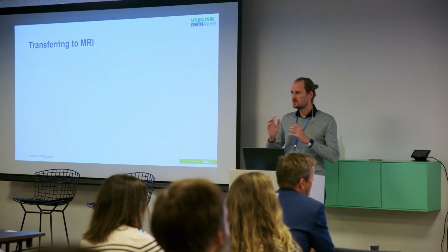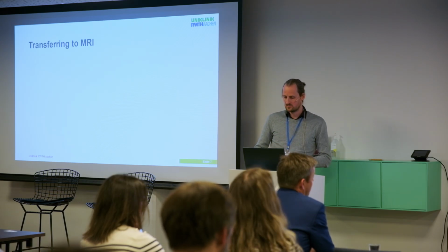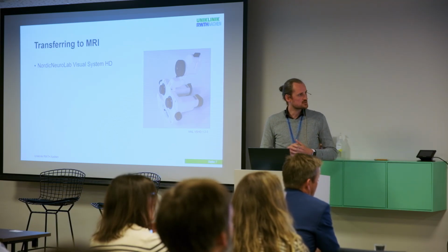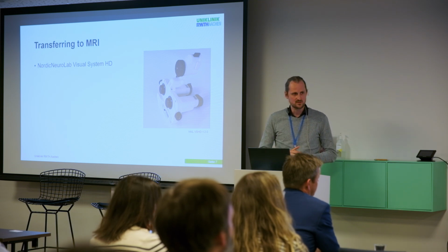So we had to transfer this to an MRI setting. So how do we do this? Well, here comes into play NordicNeuroLab with their Visual System HD. It's a bit similar, it's our goggle system used in an MRI scanner, which was already presented in a previous talk.